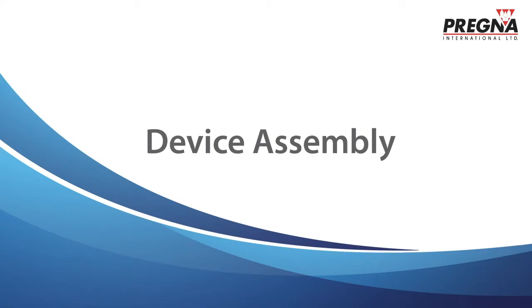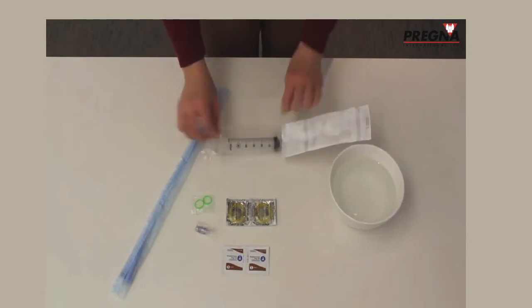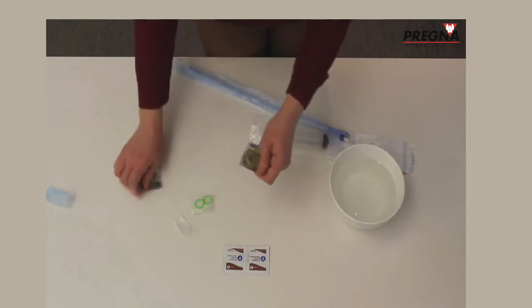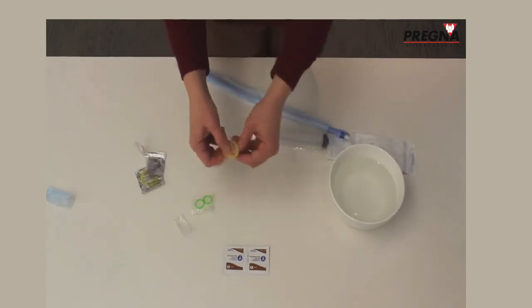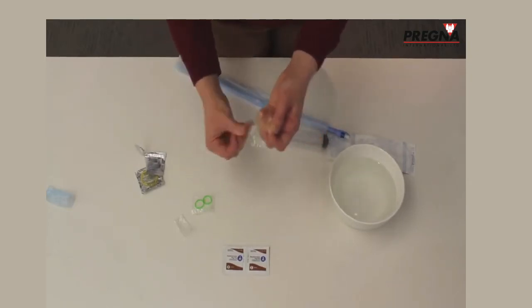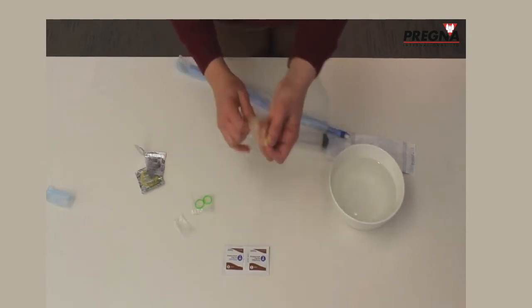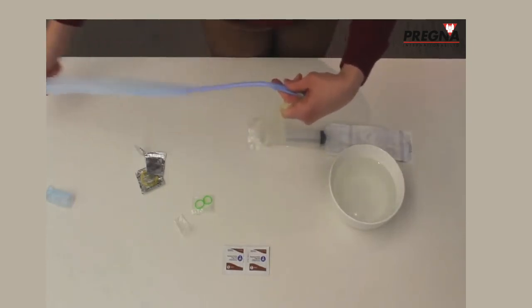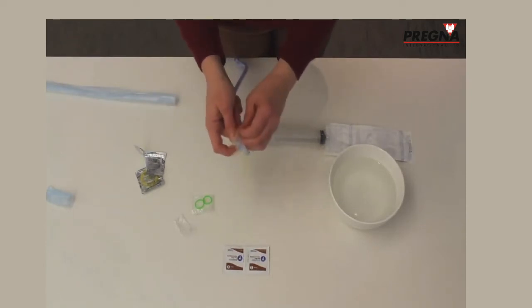For device assembly, you are going to put the Foley Catheter into a condom — the condom will be your balloon device. Open the condom, spread it out, and unroll it all the way. Then put the Foley Catheter halfway into the condom to make your uterine balloon. The condom will inflate and take the shape of the uterus to stop bleeding.